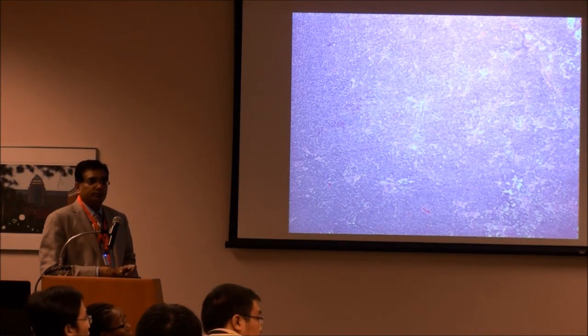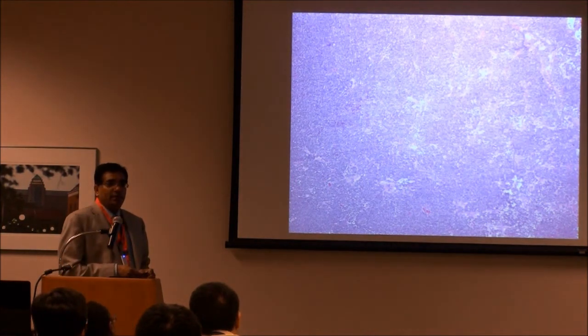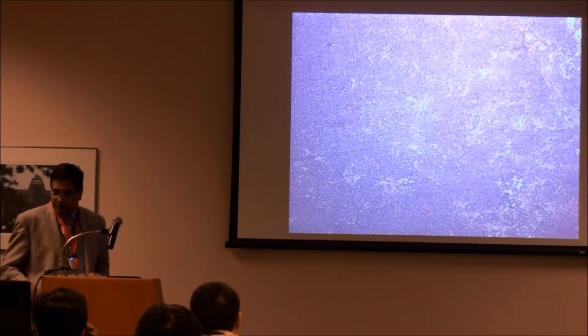Are these stained specimens for microscopy? Yes, these are H&E stained, hematoxylin and eosin stained sections.